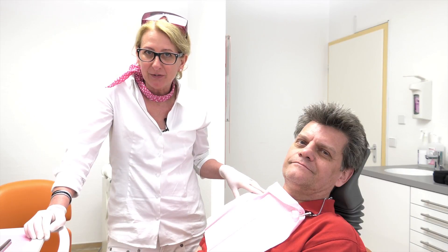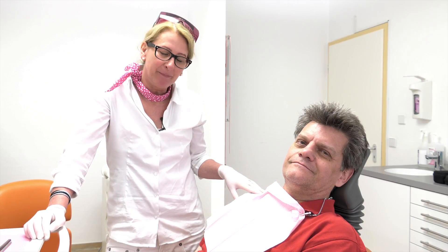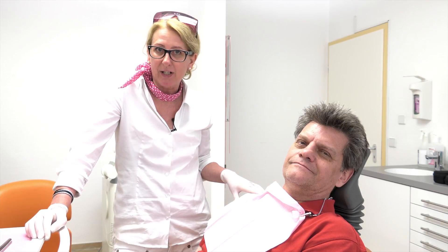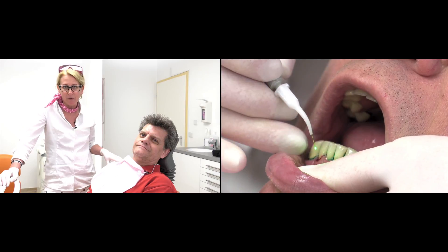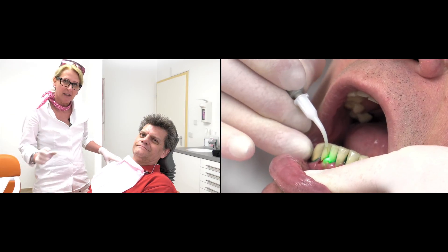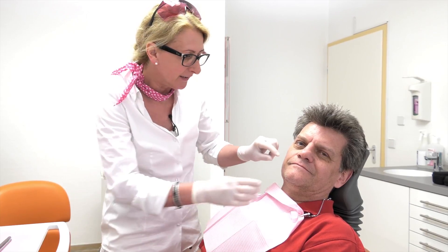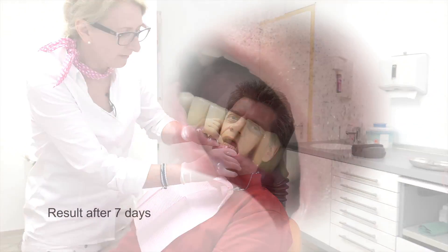Our patient is called Rainer and we treated him seven days ago. Cameraman, could you show us the situation before we started with the treatment? You can see the red gum and the inflammation. Now, after seven days, you can already see that the inflammation is nearly gone.